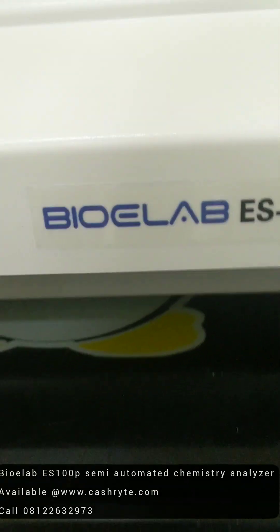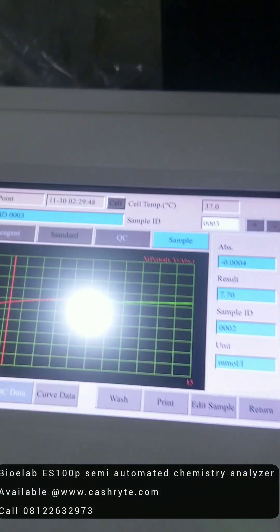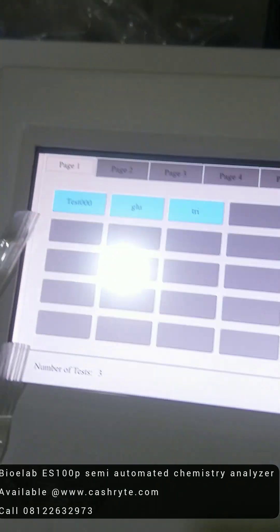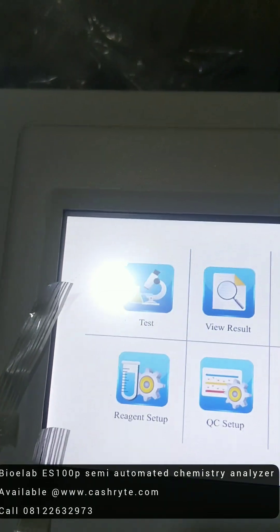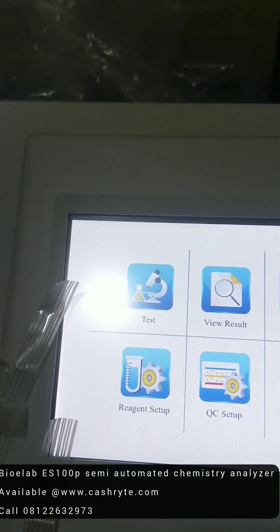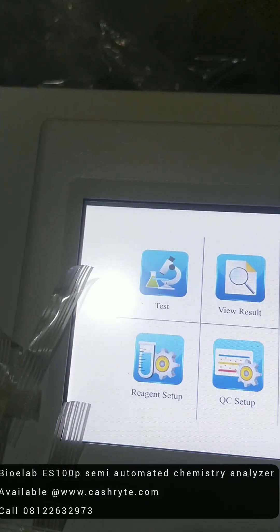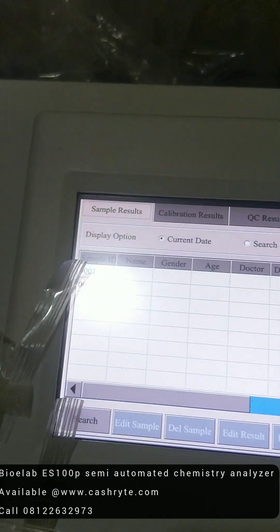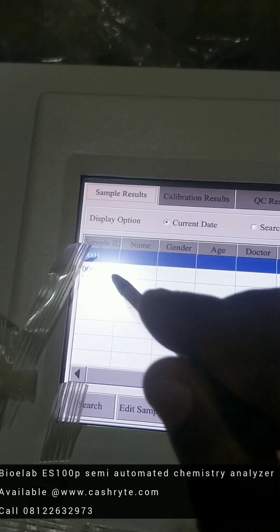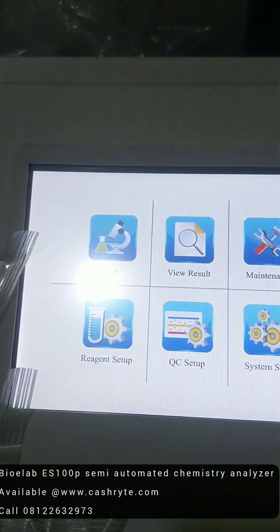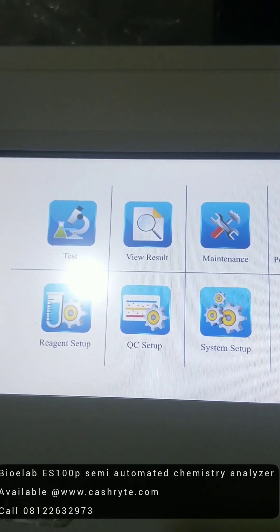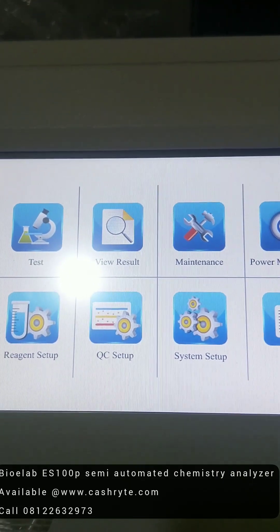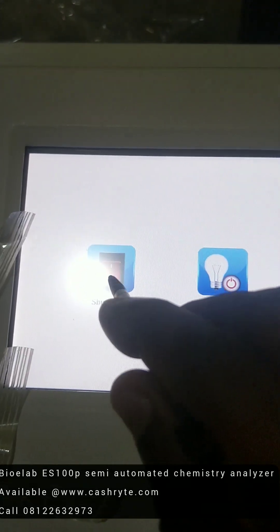So you can go to the BioE-Lab ES100P, it's on our website. You can order for it. Very affordable. So you can view your results here. You can see the results you've done for today. So you can go back. And these are the major things you need to do.